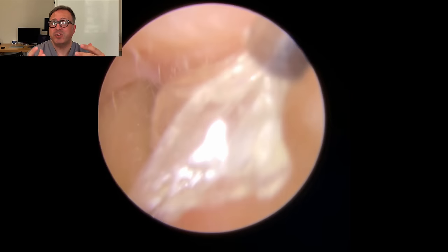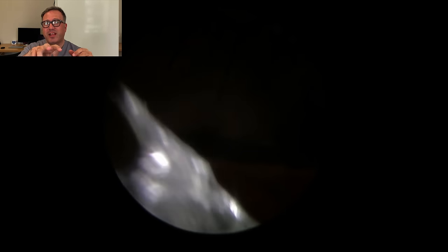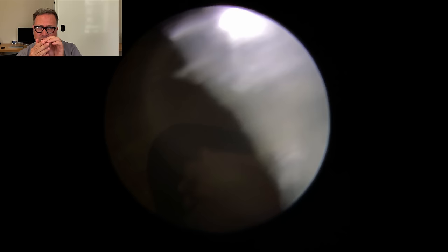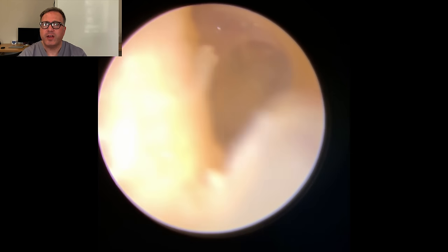Unfortunately, this bit of skin, as you see coming, it did actually get sucked inside, so I couldn't show you on the paper after. But this is what you can see, just how thin that layer was. Such a translucent piece of skin. Would have been very easy to miss. GPs never spotted it before, but really, really easy to miss that kind of problem there.